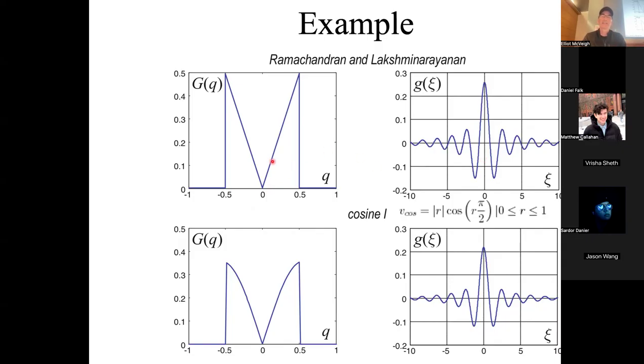Mathematically, K just keeps going to infinity, right? We can't do that. We're not going to amplify our data out and take data out to infinity, right? So we have to cut it off somewhere. And so you finally decide, okay, I'll cut it off here at this frequency.